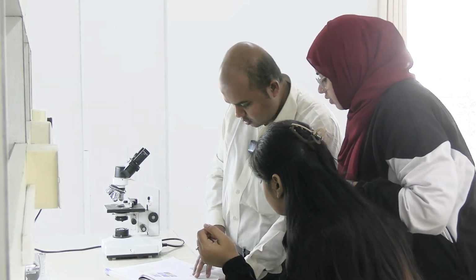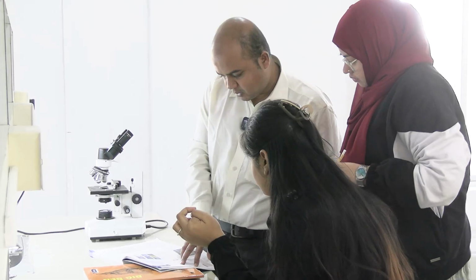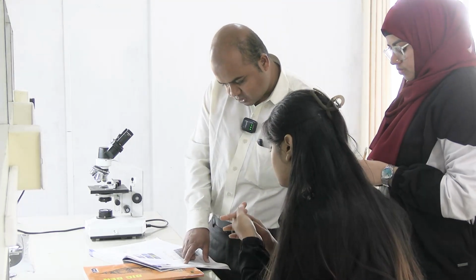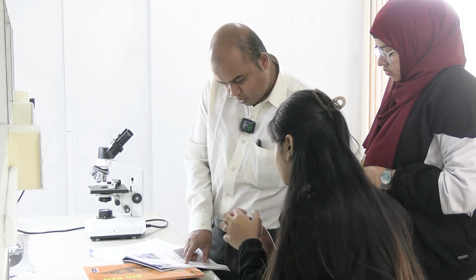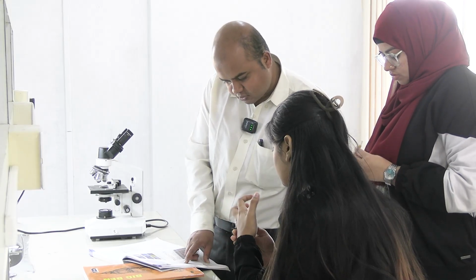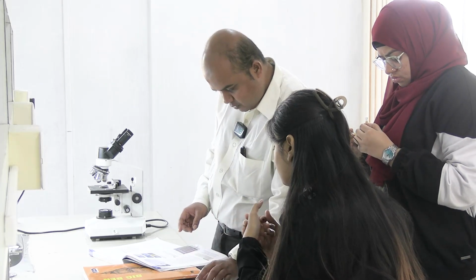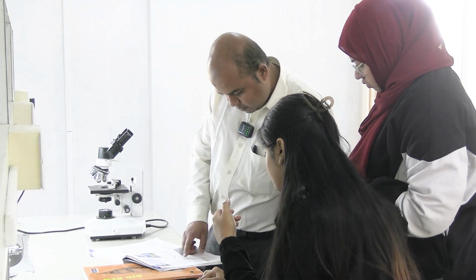See what is written: discard the first few drops of fluid from the pipette. They constitute the unmixed fluid. Charging the Neubauer chamber: a small drop of blood mixed with fluid is allowed to form at the tip of the pipette, and this drop is gently brought in contact with the edge of the cover slip at an angle of 45 degrees with the horizontal.